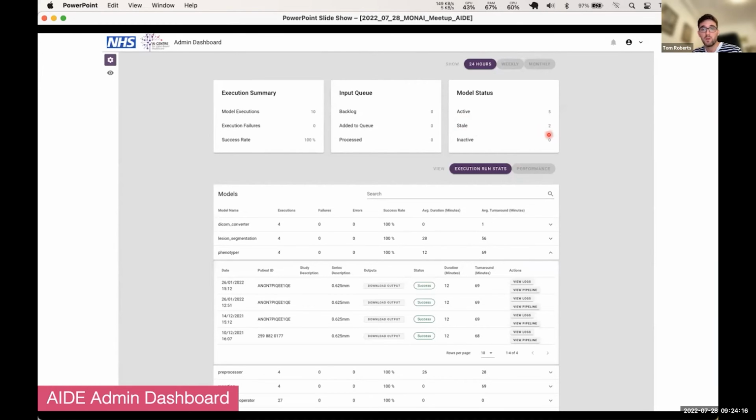So if one of the apps hasn't been used for a long time, that's something that is really important, because we want to know why it hasn't been used. Is it a problem with the app that has occurred, or is it that the doctors don't trust that app, for instance? So we can investigate that app and begin to figure out why they're not using it.